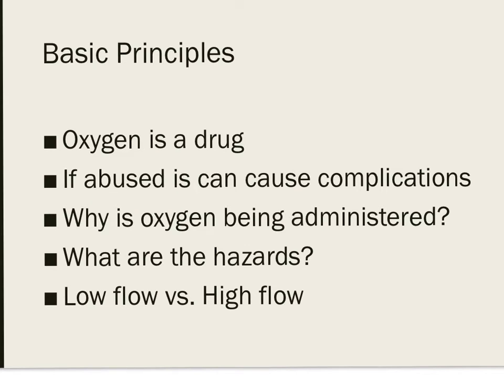Okay, just a few slides on oxygen therapy to give you guys a brief overview of some of the most commonly used oxygen delivery devices in the hospital setting. So, I think you guys realize oxygen is a drug. Oxygen therapy is considered anything that we give the patient that is above room air.